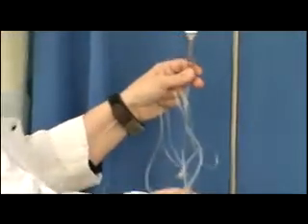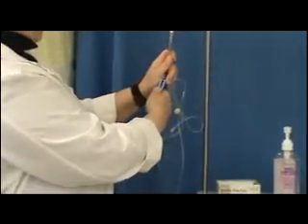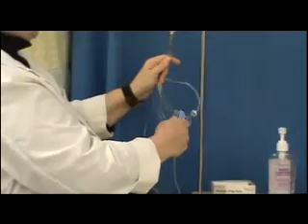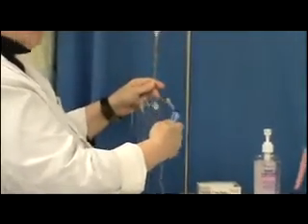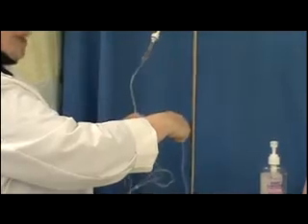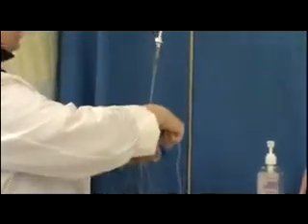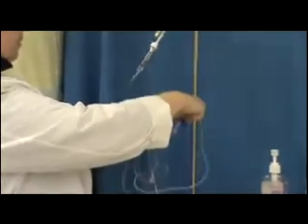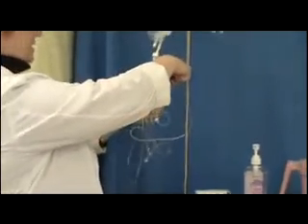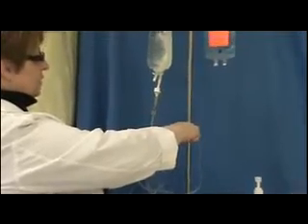We're watching the chamber here as I begin to unroll this clamp, and it will start to roll. You don't want to just open this wide and let it go. You want to go very slowly. And as the fluid passes by each of these secondary ports, you want to invert the port. So here comes, I'm going to bring this port up close so you might see both at the same time. The fluid should start to run as this roller clamp opens.